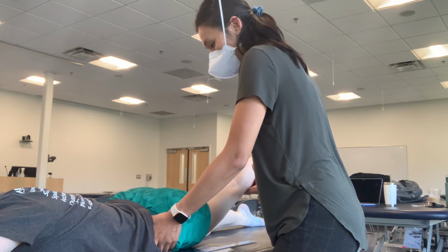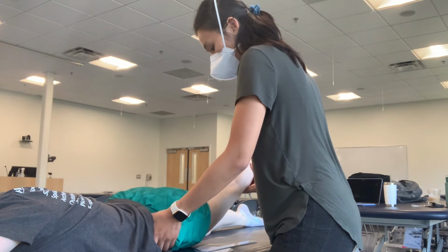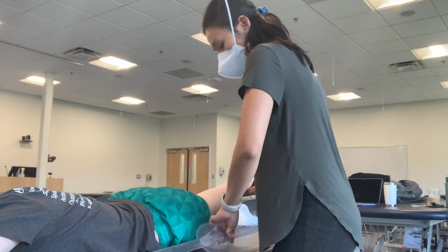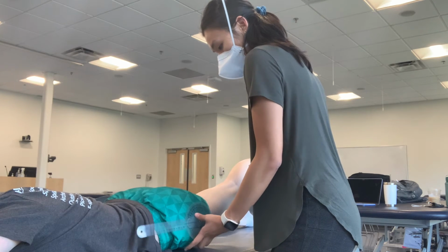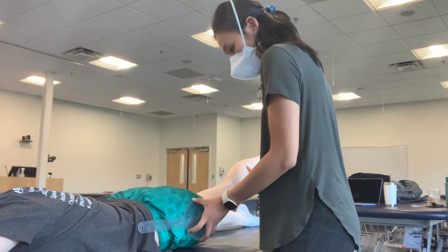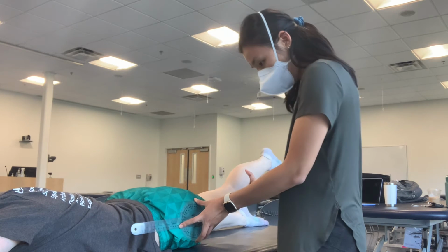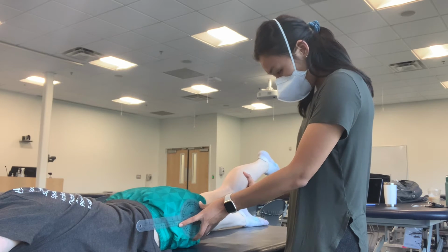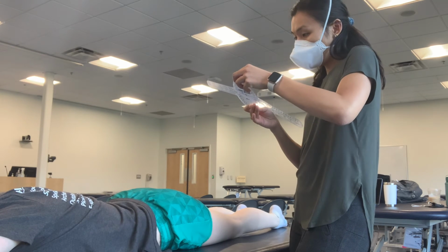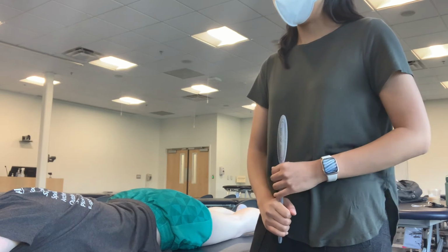So right about there, the end feel is going to be firm, and you're going to start to feel the pelvis anteriorly tilting. So we're going to place the fulcrum at the greater trochanter, the proximal arm lateral to the pelvis, and then we're going to place the distal arm lateral to the midline of the femur. So I got 14 degrees, which is a little bit lower than normal, but still good.